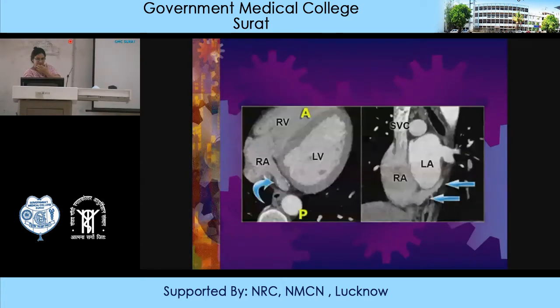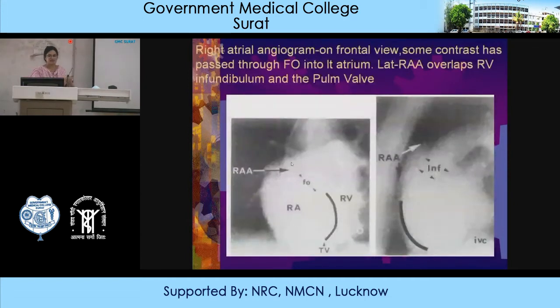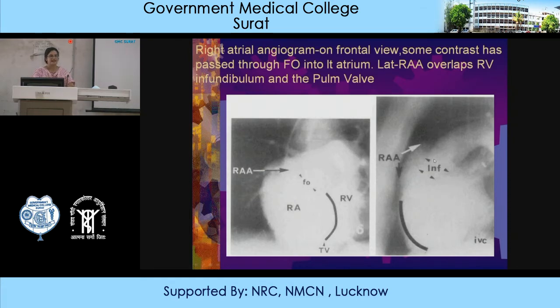This is a selective right atrial angiogram showing how the right atrium is situated in the thoracic cavity. On the frontal view you can see the right atrium, the tricuspid valve, and the right ventricle situated more anteriorly. On the lateral view, only the right atrial appendage is projected and is seen to overlap the infundibulum and the pulmonary valve.